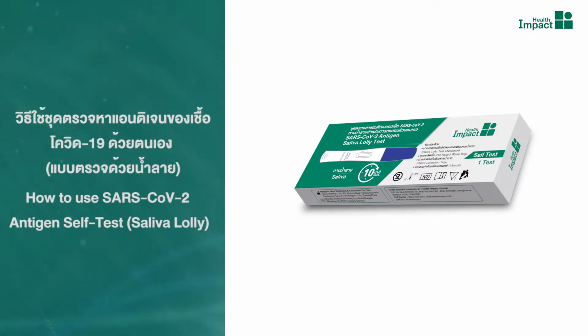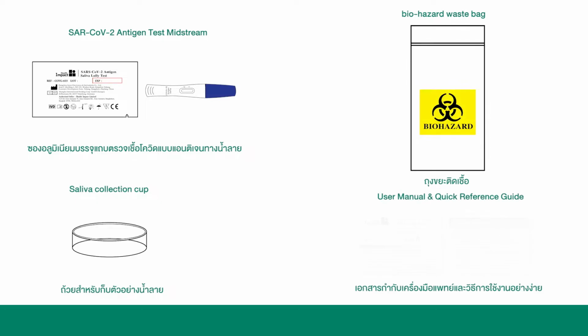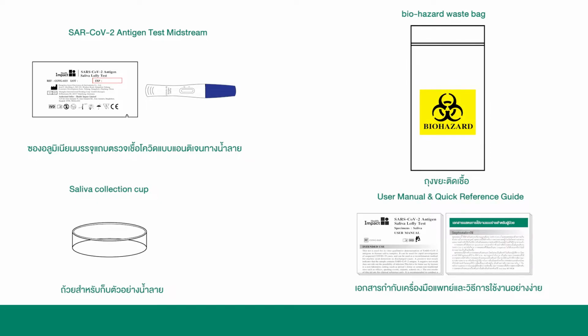How to use SARS-CoV-2 antigen self-test, saliva. Components of the test kit: SARS-CoV-2 antigen test midstream, saliva collection cup, biohazard waste bag, user manual and quick reference guide.